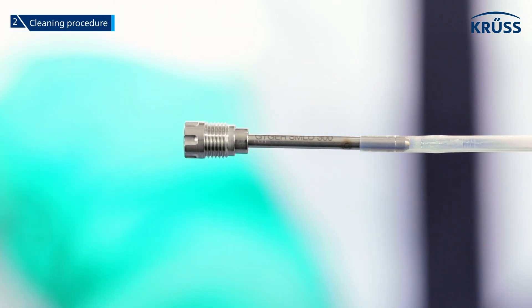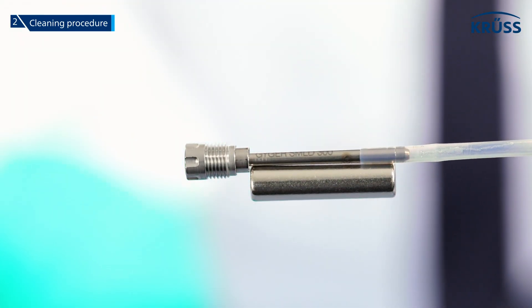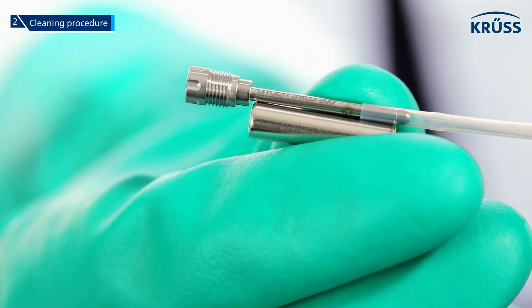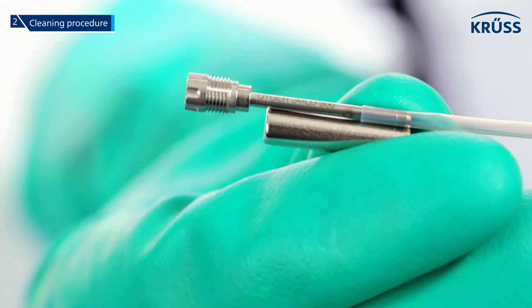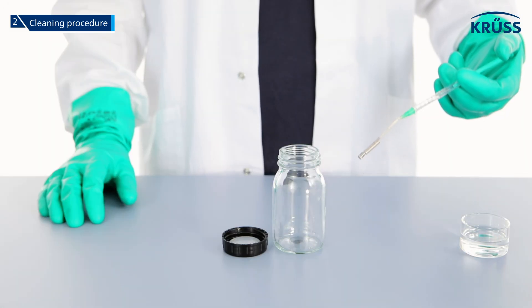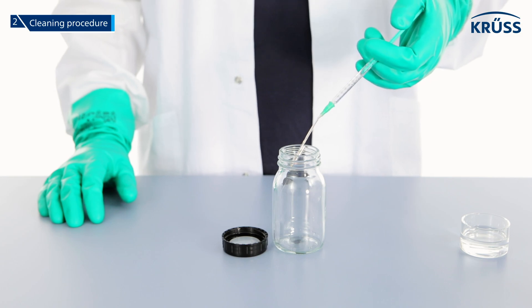Position the rod magnet parallel to the valve. The magnet will open the valve. Move the rod magnet several times along the valve. Then push half of the isopropanol in the syringe through the valve into a separate waste vessel.